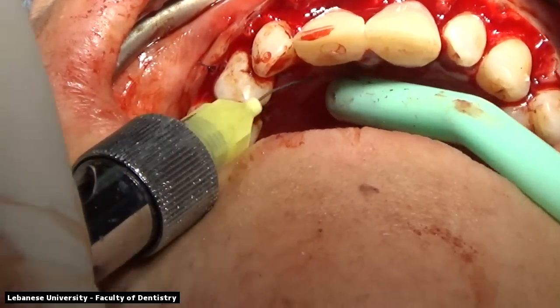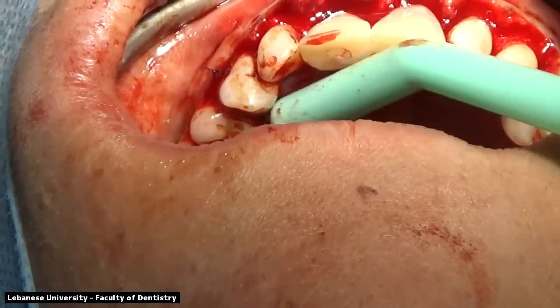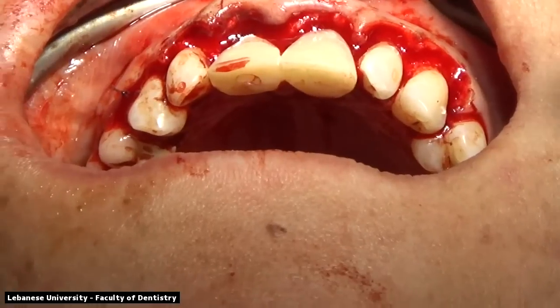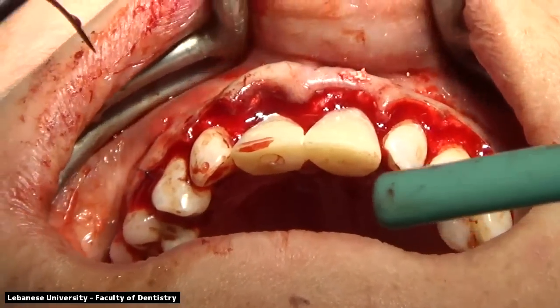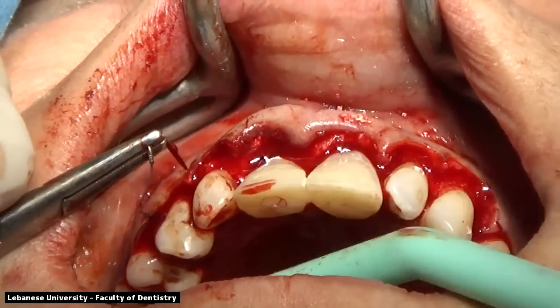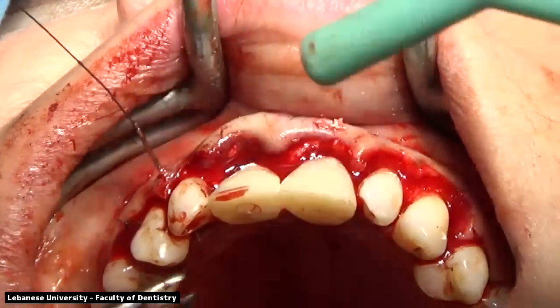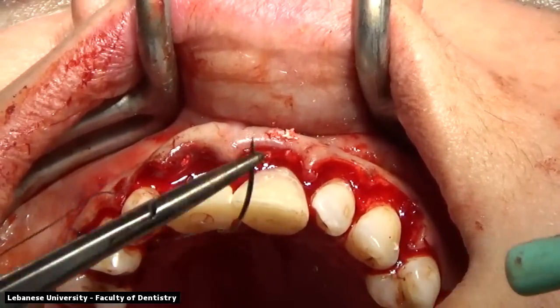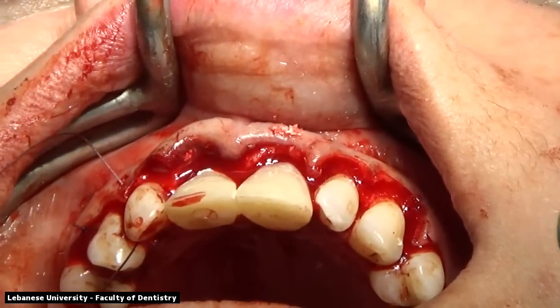So to recap, the important aspects of this case is make sure that you check the gingival margins of the neighboring teeth if you're doing implants in the aesthetic zone. If the gingival margins are at a discrepancy, you might be needing to do a crown lengthening procedure and not just an implant procedure. Because in this case, if we would have done just an implant procedure, the patient would have thought that there was some remodeling or something wrong with the implants because the implant crowns will be longer than the lateral and the canines, which are neighboring to those two implants.